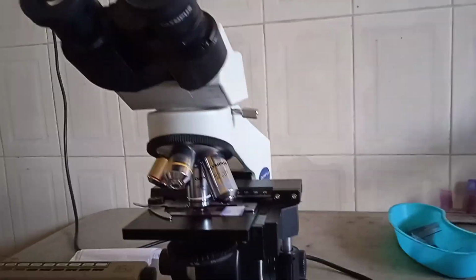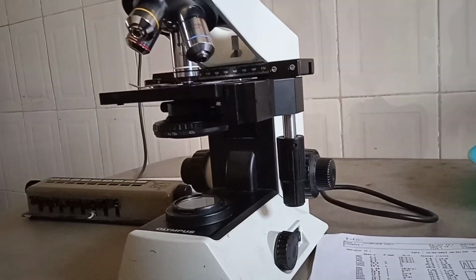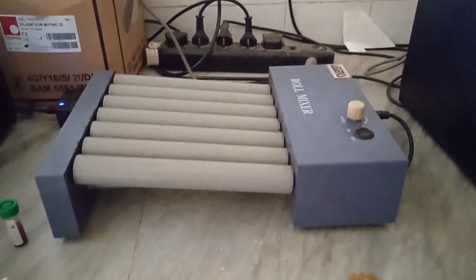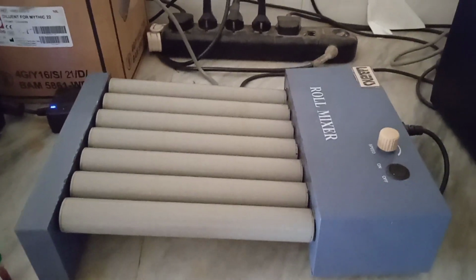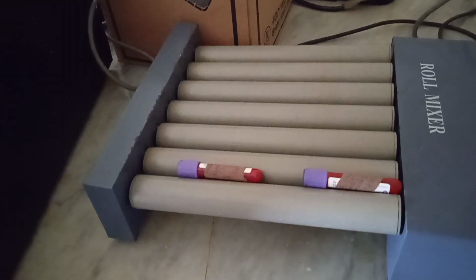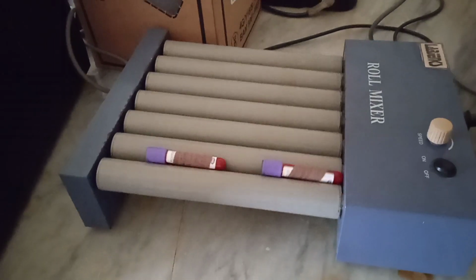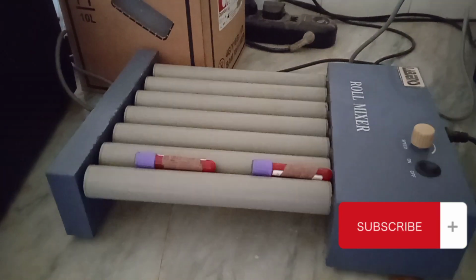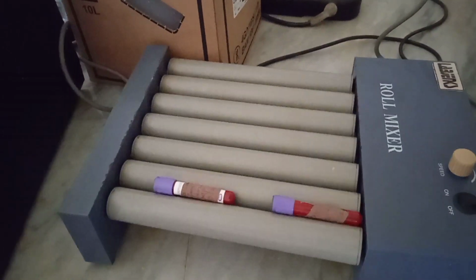And this is the microscope that we use here. It is used for viewing stained slides in the hematology lab. And this is the roll mixer. This actually helps to mix the blood before you perform any test in the hematology laboratory. And you can see how it's working here. This works really nicely.